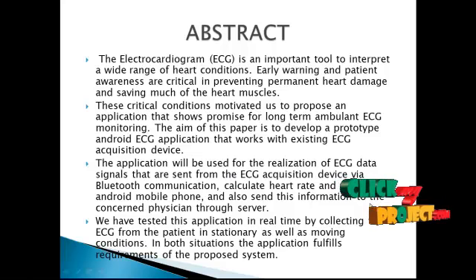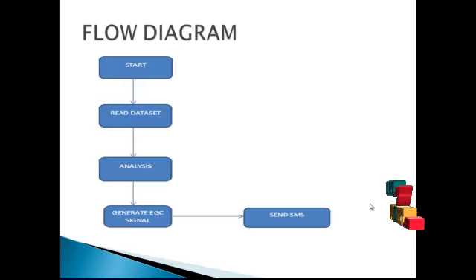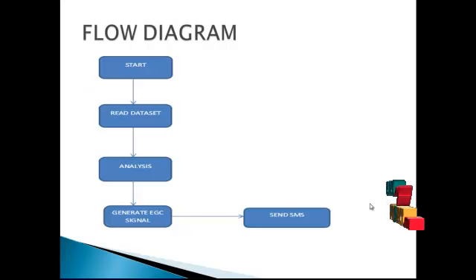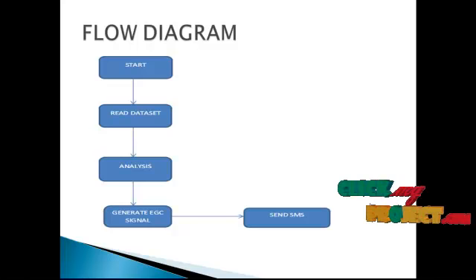Let's see the data flow diagram of this project. First one is the start module, another one is the read dataset module, next one is the analyze module, next one generates the ECG signal, next one is the send message.